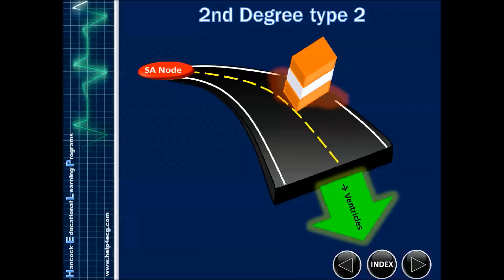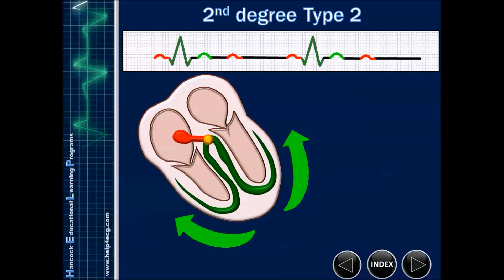But the other lane is okay. And so what's going to happen here is that either it's going to go down the easy path, and it's going to be a normal PR interval and a normal QRS, or if it goes down the blocked path, you're going to get no QRS for that P wave. So it means that when I do have a PR interval, it should be normal. And otherwise, I won't have a PR interval because I will have dropped my QRS.